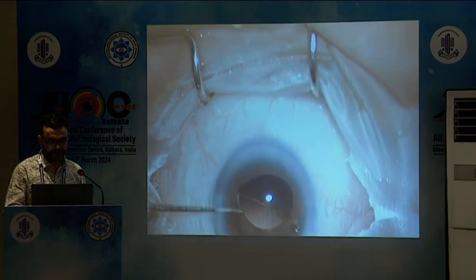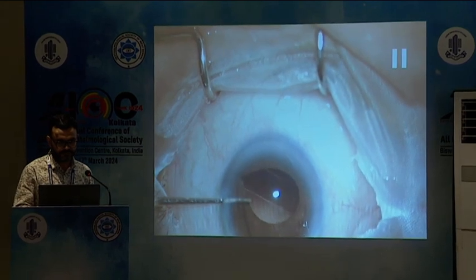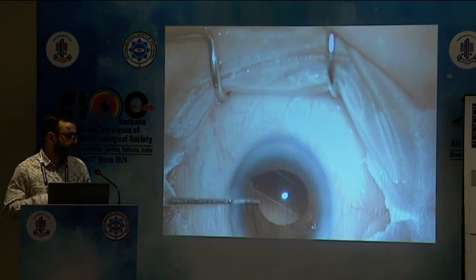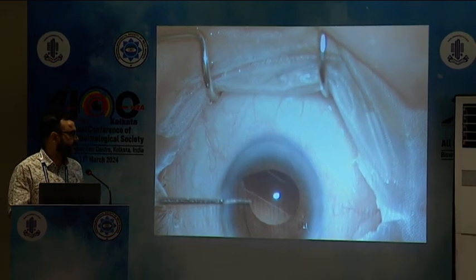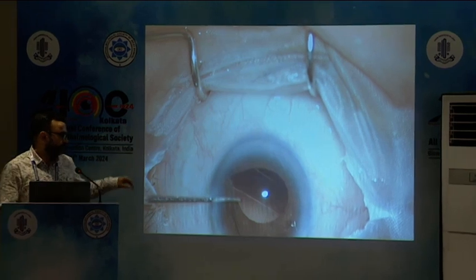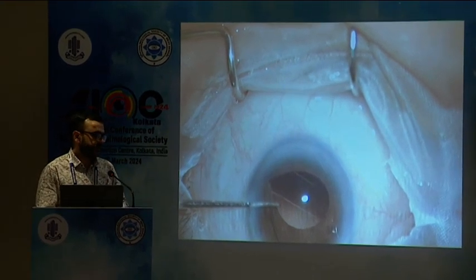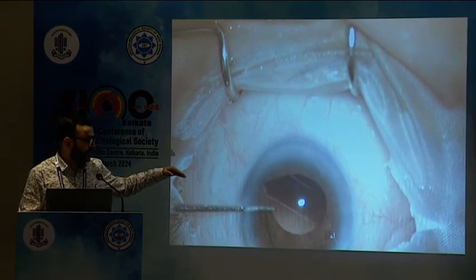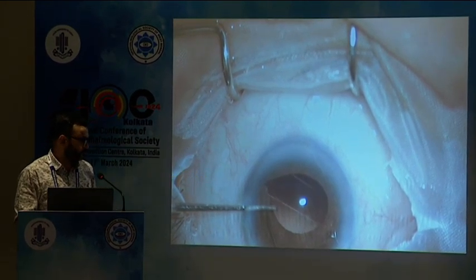About midway of inserting the CTR, what I want to highlight here is that the pupil is not very dilated at present. 50% of the CTR was in, but there is some stretch line that appeared horizontally.